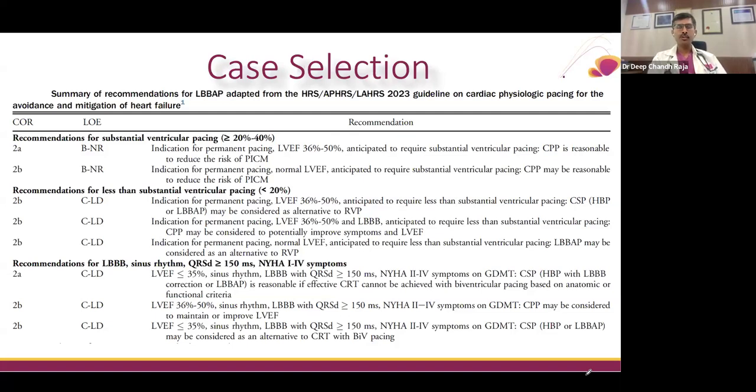Which patients do you select before you plan them for left bundle branch pacing? This is a complex slide taken from the latest guidelines from the Heart Rhythm Society, Asia Pacific and Latin America Heart Rhythm Society guidelines. Let me summarize the guidelines to you in 2 boxes.